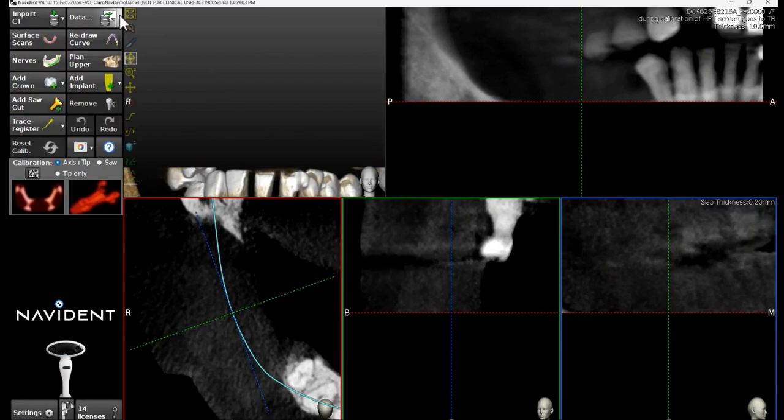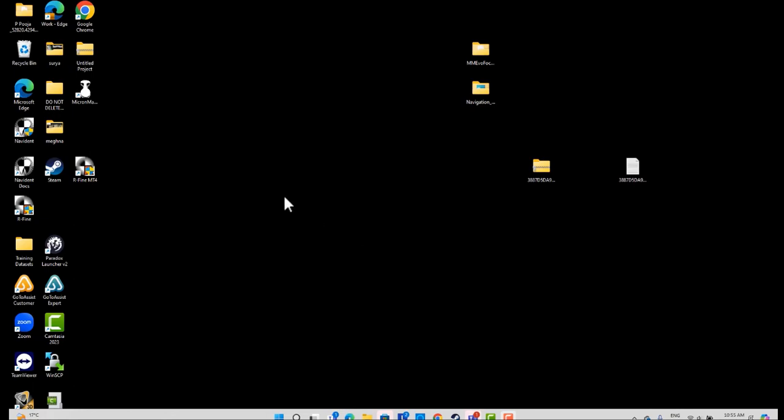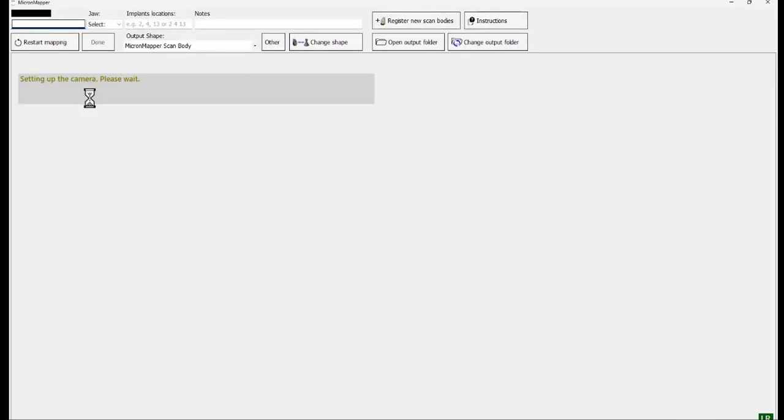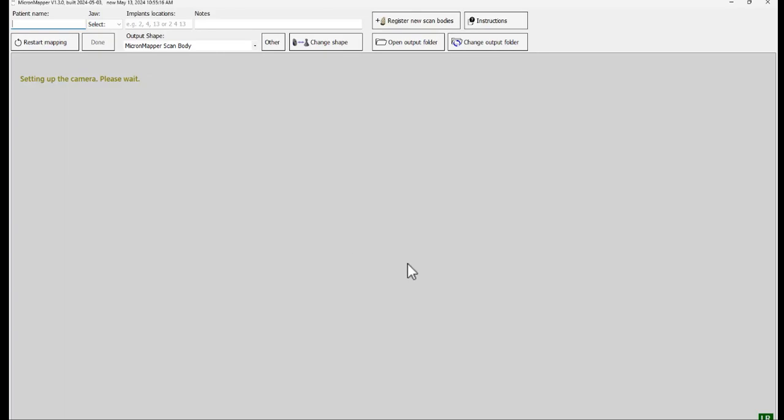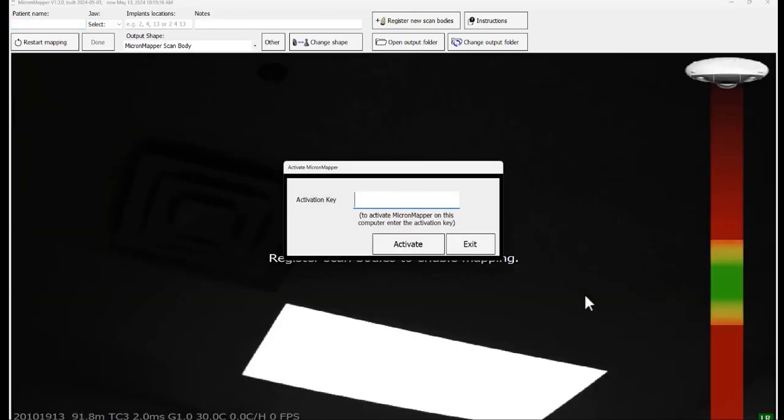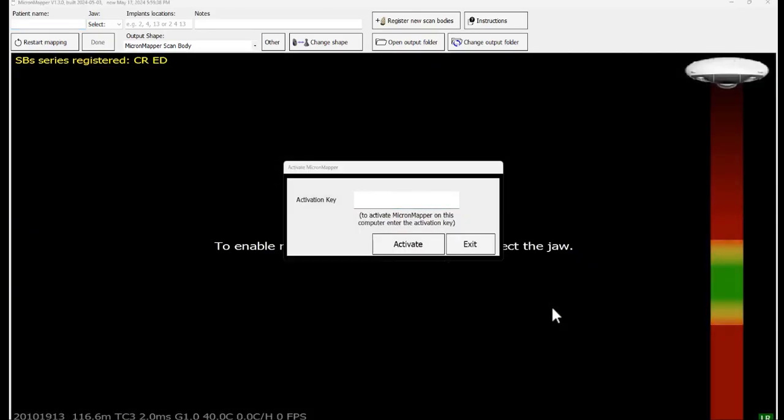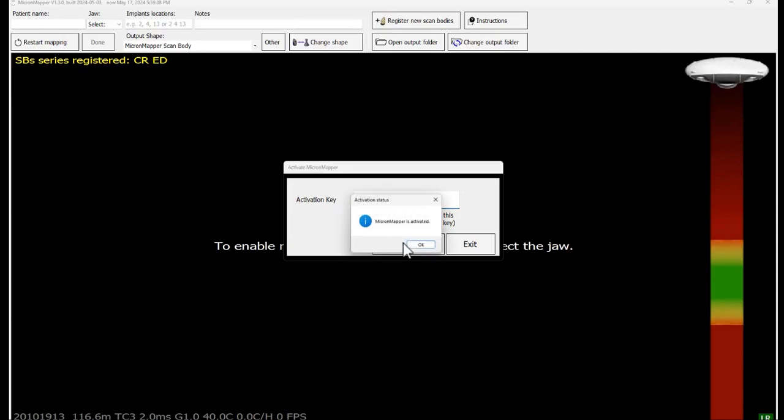This application can be opened either from the Navident application or directly from the desktop. After opening the application, it will ask for the activation key. Enter the activation key provided with your order and click on activate. A pop-up window will come up stating the activation status. Click OK.